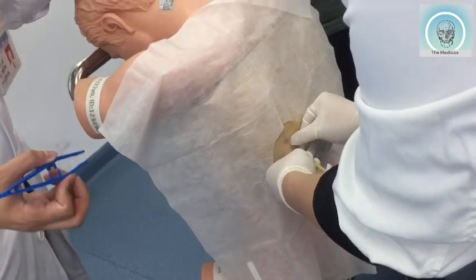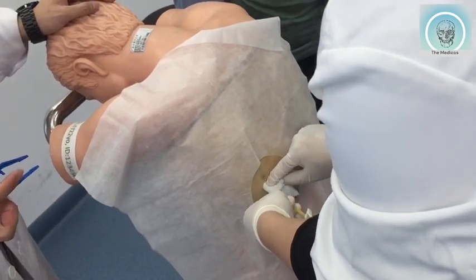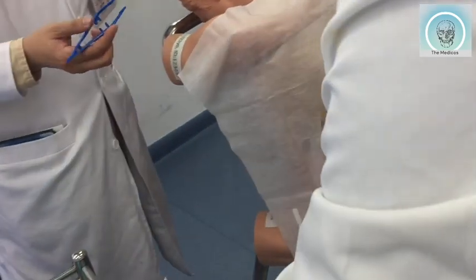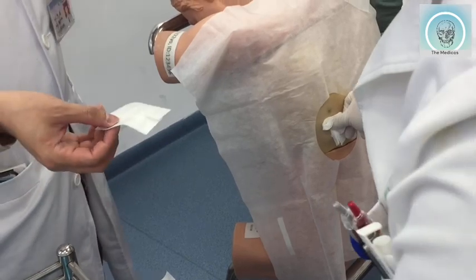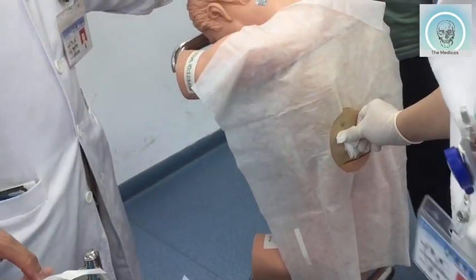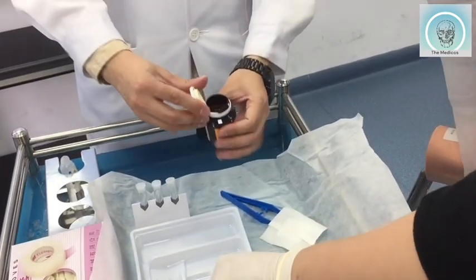If you finish all the times, ask the patient to breathe in, breathe out, and hold his breath. You make a shot. Hold it back. And then, after the procedure, I'm drawing some antiseptic here.